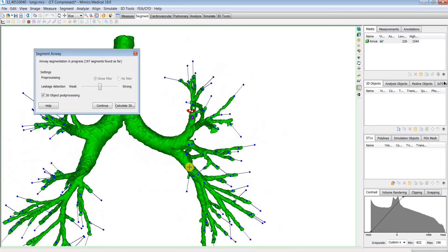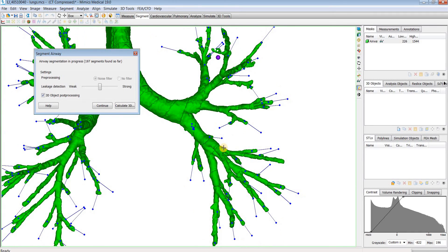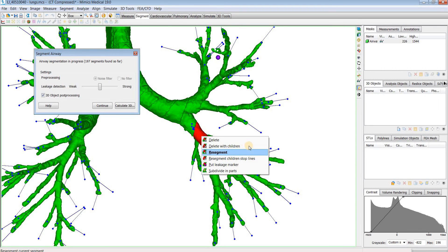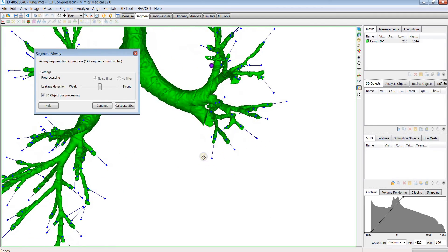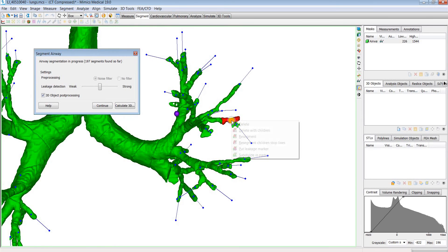Other things you can do to edit this: if you want to delete any branches, you can just left-click on them, right-click, and hit Delete. If you want to delete farther up and delete everything below that — maybe it's segmented farther than you need — you can click a segment farther up, then right-click and select Delete with Children. You can also subdivide a segment into parts and only delete part of it if needed.